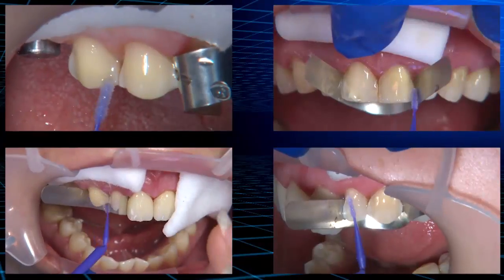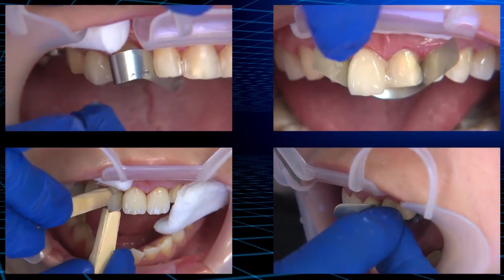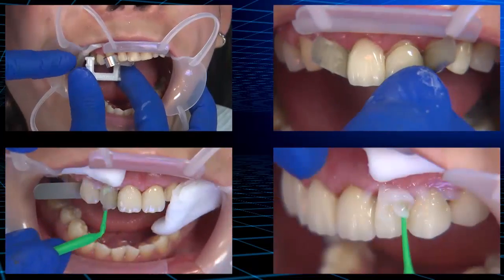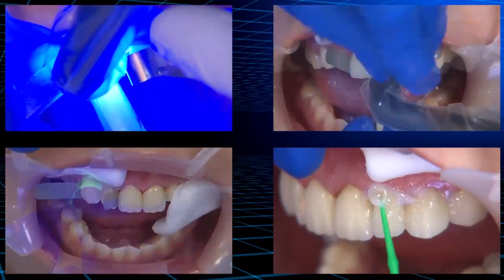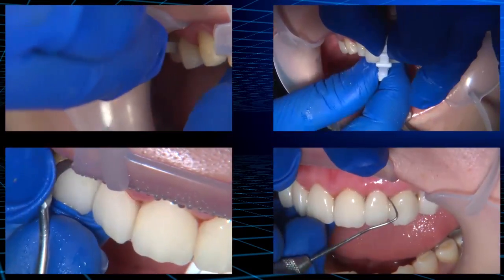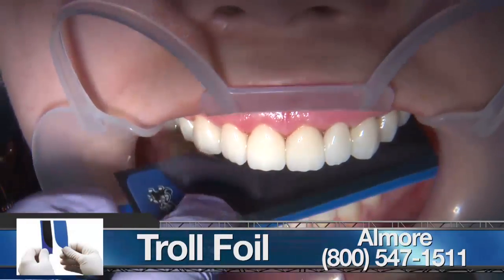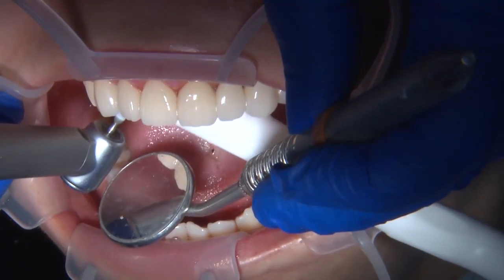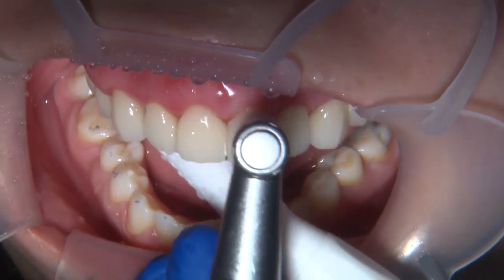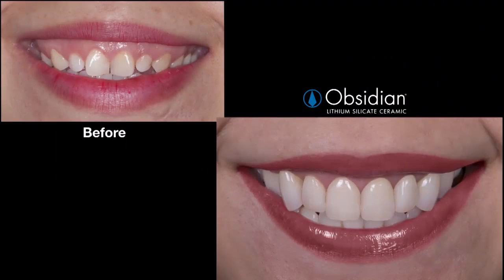With an average biaxial strength of 397 MPa, obsidian lithium silicate ceramic exceeds the strength requirement for all-ceramic restorations, making this material a good choice for this case because the veneers were extended posteriorly to the maxillary premolars. Patient bite and lateral excursion were checked and final restorations were evaluated for phonetics. After all necessary adjustments, a rubber cup was used to polish the final restoration. Overall, this obsidian smile makeover exceeded our patient's expectations.